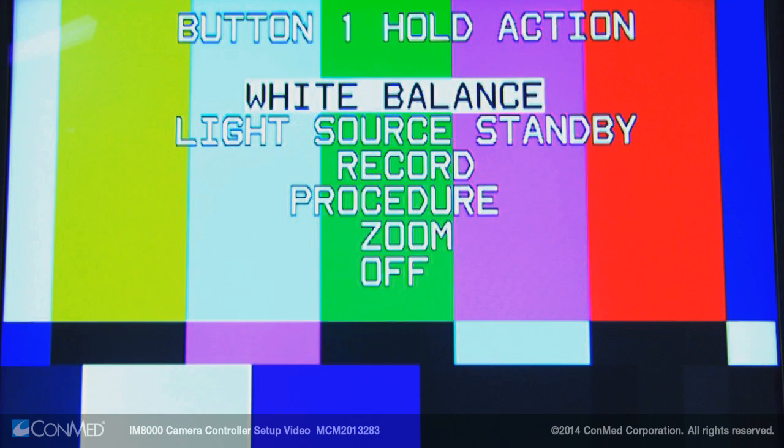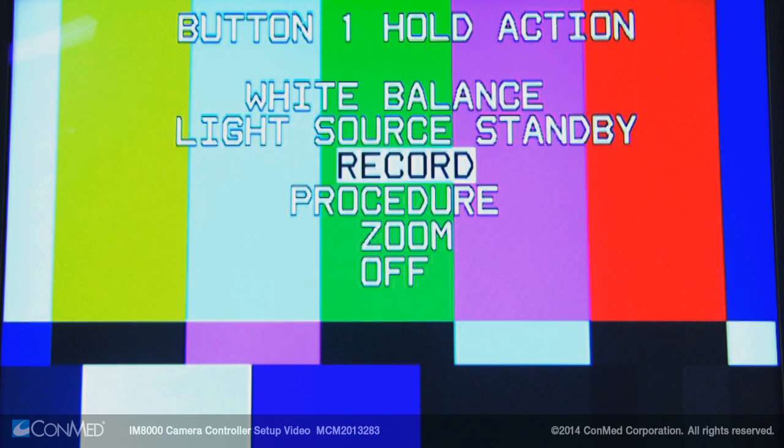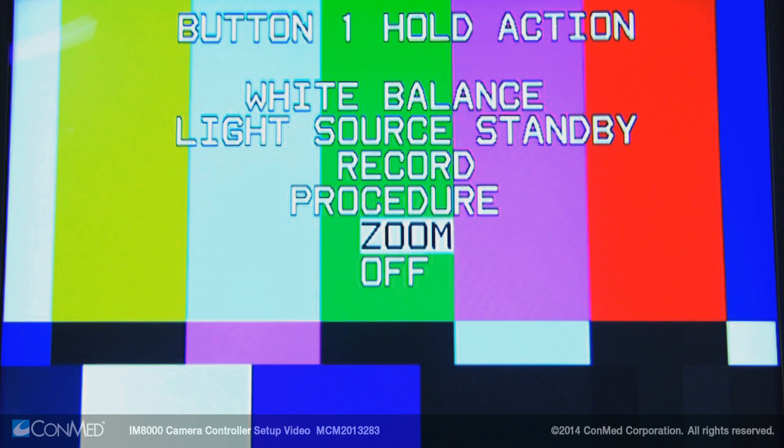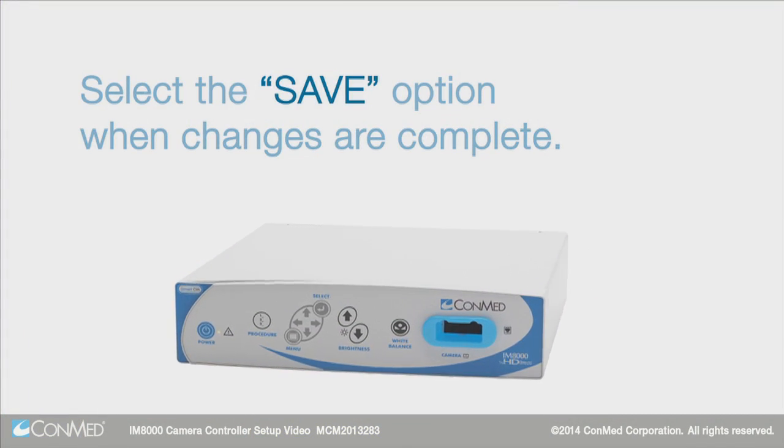The hold action, formally called long press, can be configured to perform a white balance, put the light source into standby mode, record video, select a procedure preset, zoom in or out of the image, or have no action at all. Select the save option when changes are complete.